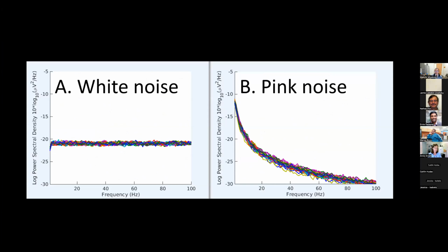So the differences we saw when we compared A and B can be best explained by this power spectral density plot. So A is white noise. White noise, by definition, contains the same amount of energy across all the frequency ranges. So it's kind of funny to say that in EEG, delta and alpha have power, and gamma has the same amount of power. That's flat. So if there were such EEG data, then it should look like plot A. But almost always, what we see in genuine EEG data is closer to pink noise, which has this 1/f curve.